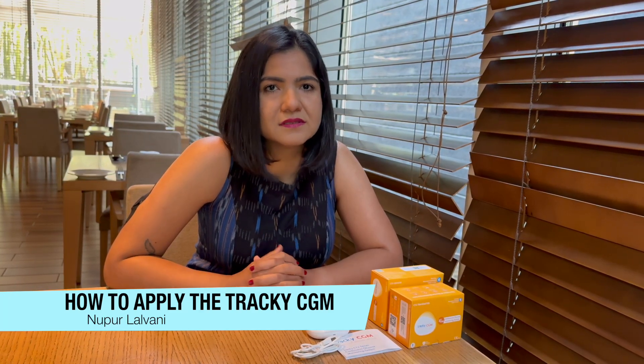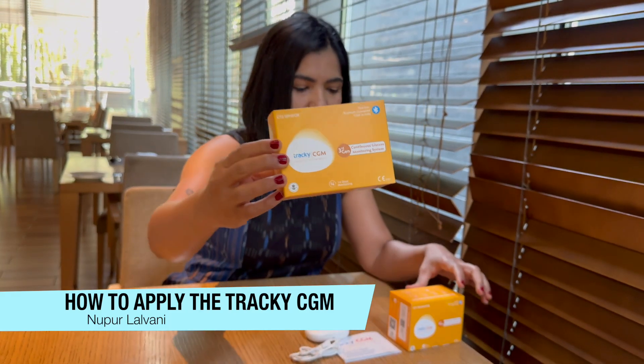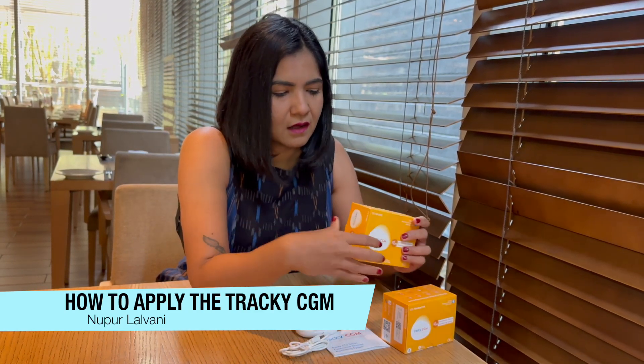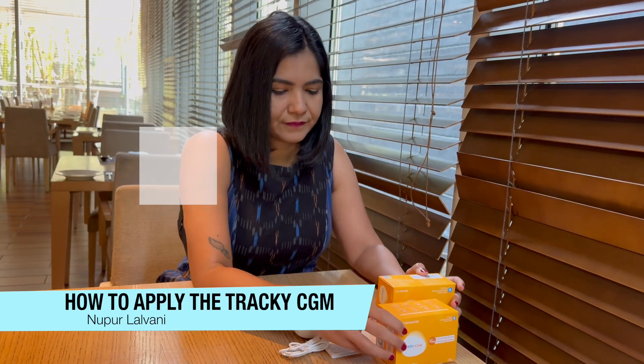We've been doing reviews, tutorials, and blogs on all of these CGMs. And today I'm going to show you what the Tracky looks like. This box right here is the sensor box. You'll get two boxes when you order a Tracky CGM, and this is the transmitter. The pricing for the Tracky — the out-of-pocket cost for CGMs is, as you know, quite significant. This sensor box costs about 3,899 rupees, and if you buy the transmitter and the sensor together, it costs about 5,249 rupees.